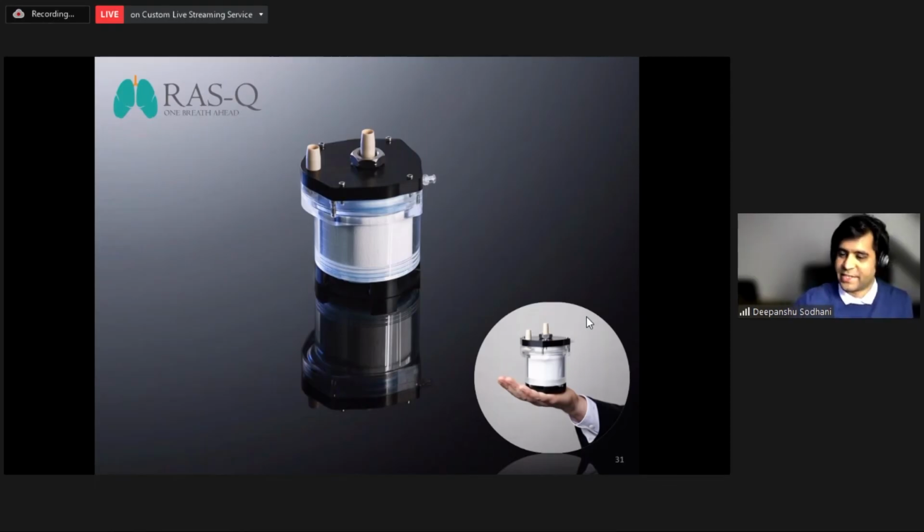I think that is often limited by the fibers themselves, being 300 microns or even less in diameter, and expanding those would mean developing a new kind of hollow fibers. These fibers are already very limited and pretty expensive. So that is definitely an R&D space one can look into. But at this point in time, the idea for us was to use what is commercially available and incorporate those technologies to get it to patients as quickly as possible.